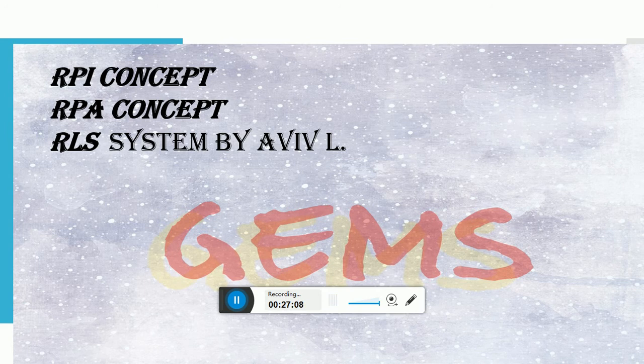The proximal plate contacts only 1 mm of the guide plane, which is only 2 to 3 mm high occlusogingivally. I am repeating again. The proximal plate contacts only 1 mm of the guide plane, which is only 2 to 3 mm high occlusogingivally. And the I bar terminus is a pod shape to allow more tooth contact. Okay, this is the RPI concept.